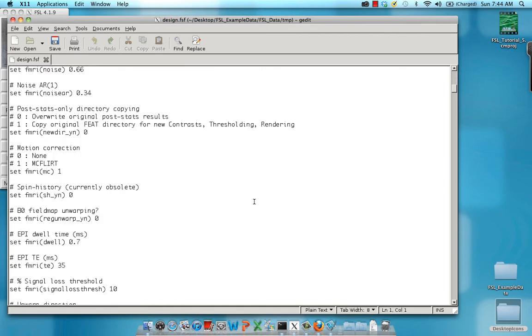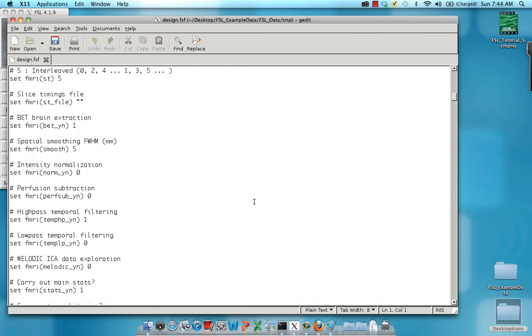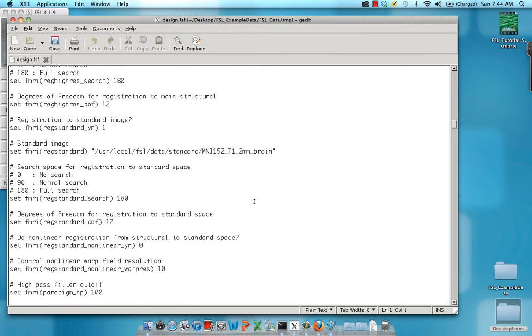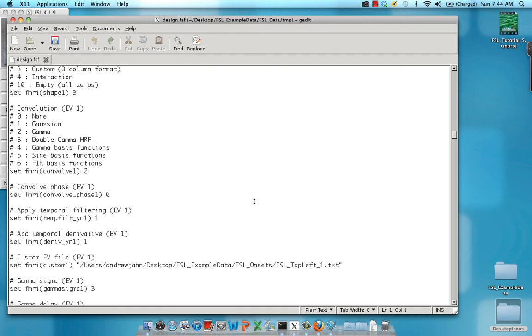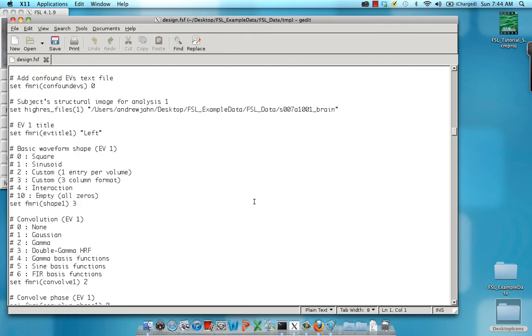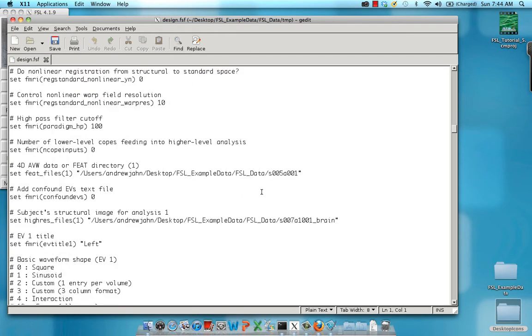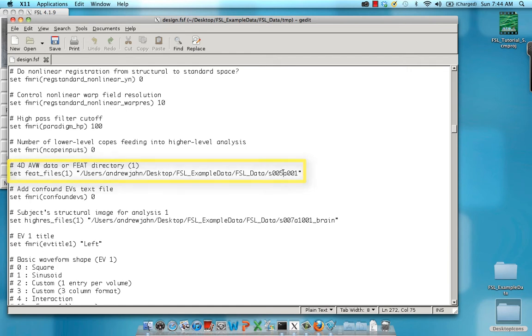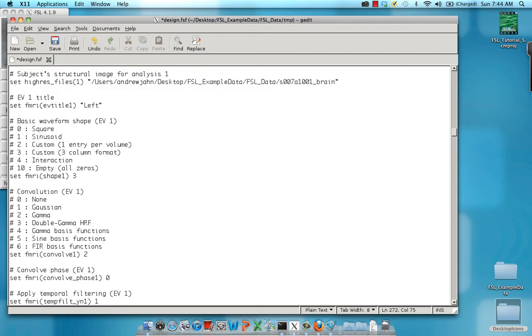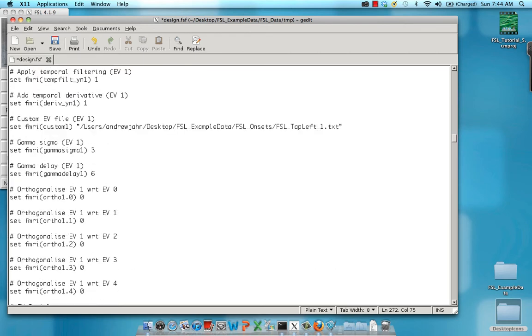So what do we want to search and replace for? Well, first thing is we want to go to this line right here, which is 4D AVW, same thing as FSL data or feat directory. And I'm going to change this to s006 because that's the next functional run.